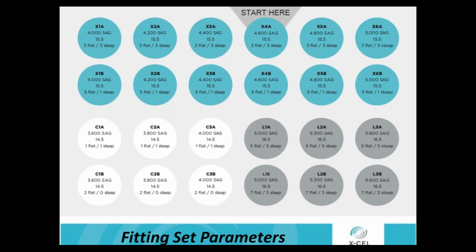So the depth of that lens, and then once we put that lens on, the relationship of the sag of that lens to the cornea. So how much clearance do we have? So we put a lens on and then we work from there. We can increase our sag if needed or decrease the sag if needed by changing lenses. In our design, we can also manipulate this sag, the central sag, without affecting any other part of the lens.